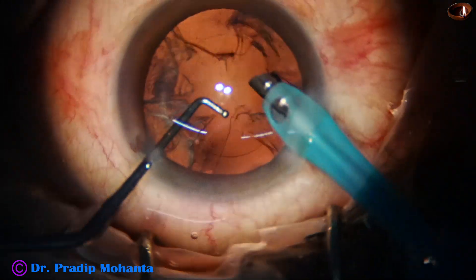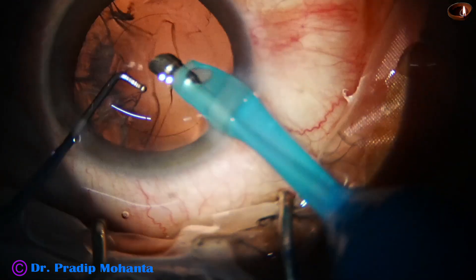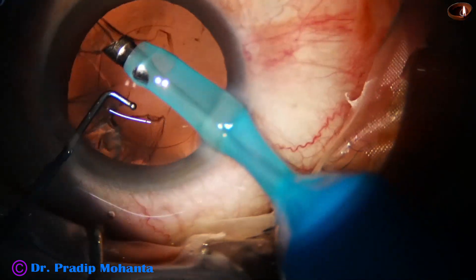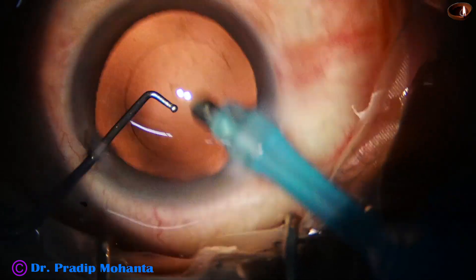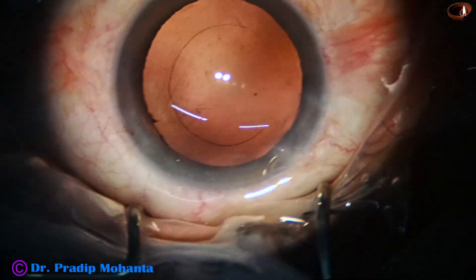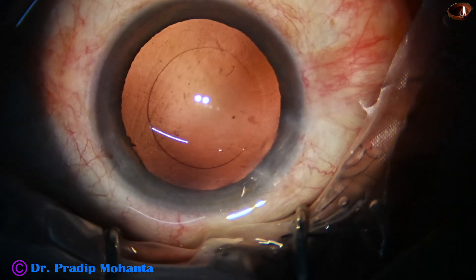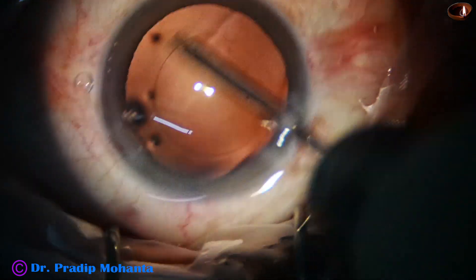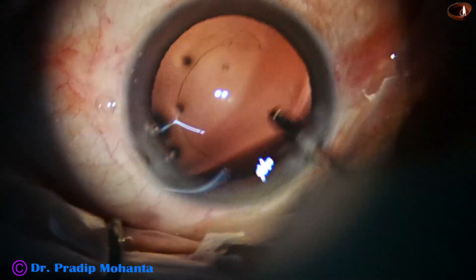Now I am trying to remove the cortex with the handpiece itself. If you practice this in routine cases gradually, and at any point you feel it is going to be dangerous, you will stop. The nucleus sustainer is kept at a level about two millimeters below the handpiece, and we can protect the posterior capsule with the nucleus sustainer — the ball-tipped instrument.